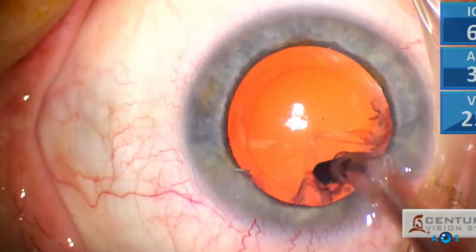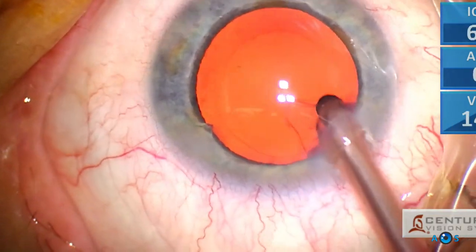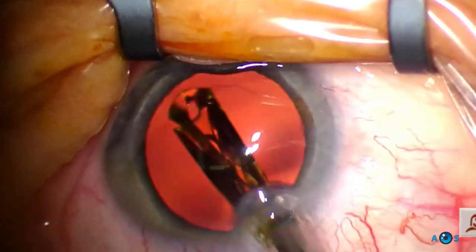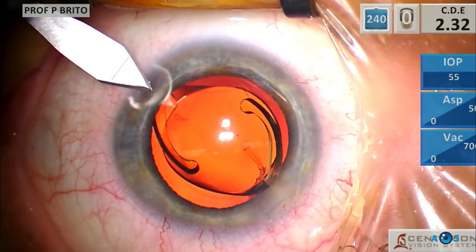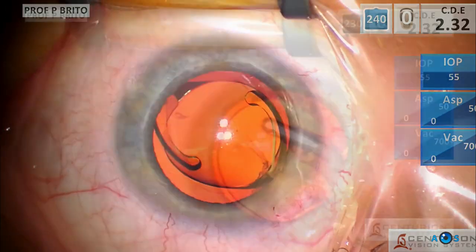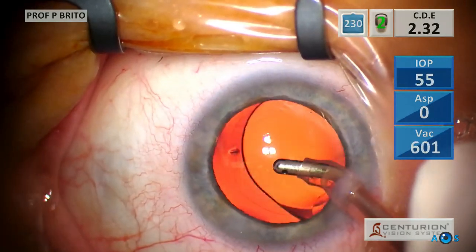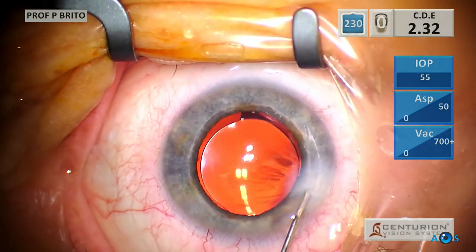The subincisional cortex is proving to be difficult to remove, so it is a good strategy to implant the IOL and then safely aspirate it. To reduce corneal astigmatism, the 2.4 mm corneal blade is used to create an adjusted contralateral incision. Now we safely remove the OVD and the remaining subincisional cortex. The IOL is centered in the capsular bag. Time to hydrate all the corneal incisions.